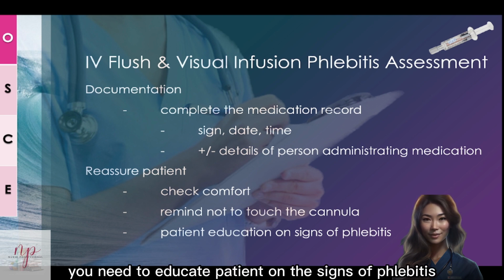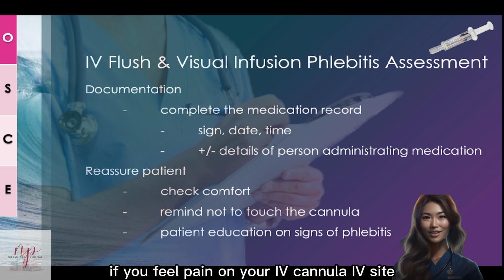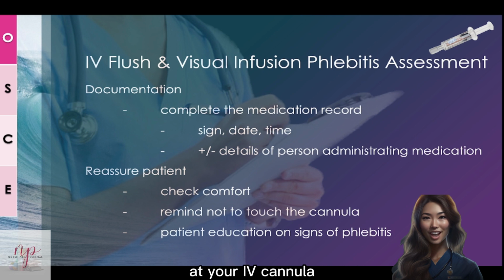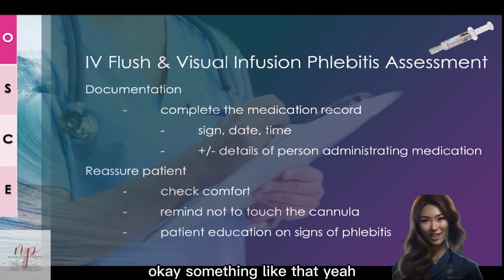And also you need to educate patients on the signs of phlebitis. So you may tell your patients, if you feel pain on your IV cannula, IV site, or you see some swelling, redness, or you palpate something hot at your IV cannula, please press the bell and let me know. Okay, something like that, yeah?